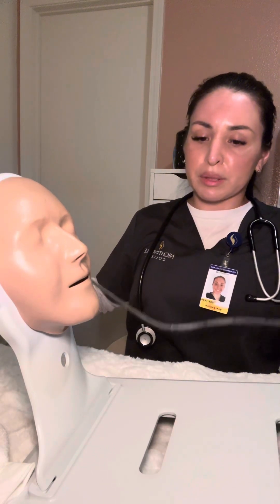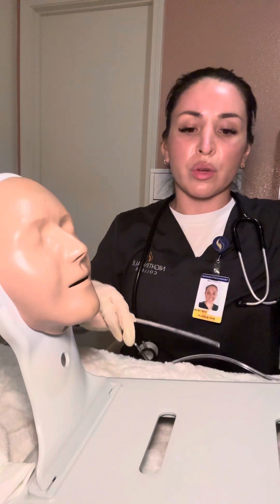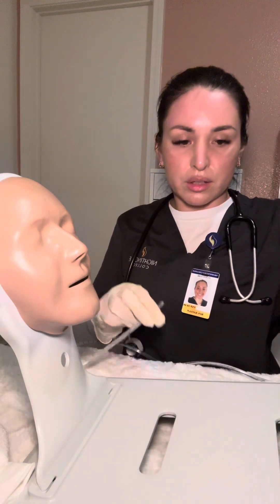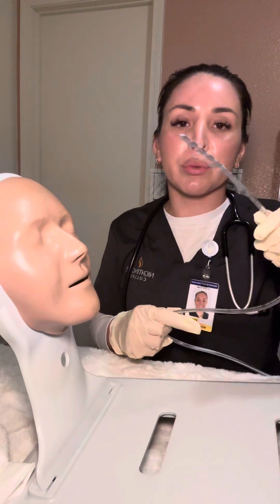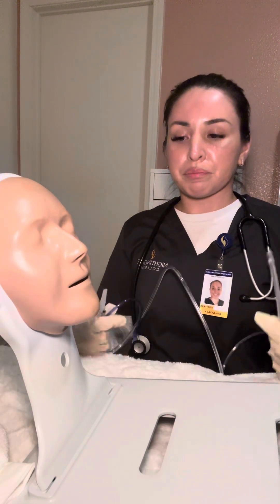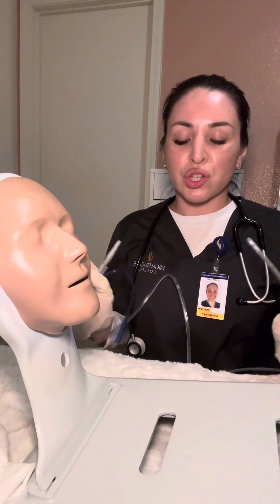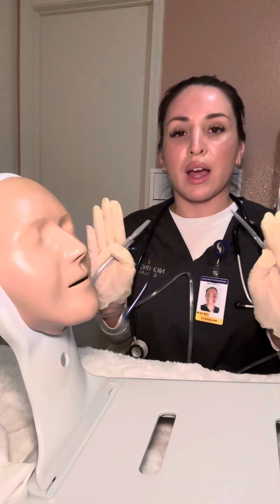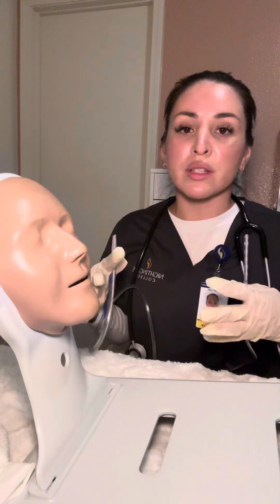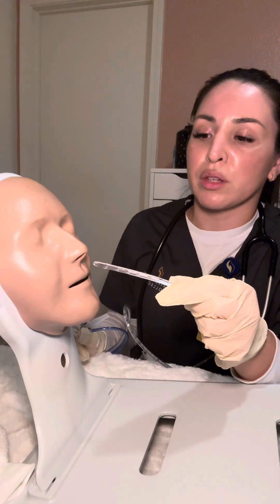Next I'm going to place the tube in the warm water of the basin to prep it, then gather my lubricant. I would take the lubricant, apply it to the tip of the tube, and then get started. We also need to make sure the patient is in the High Fowler's position, if comfortable and tolerable. Now that we're ready and the patient is positioned, we've assessed the nares and got the tubing ready, we're going to insert in the nostril with the greater airflow.